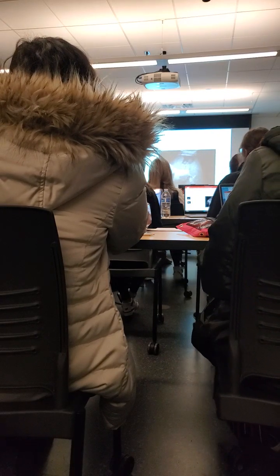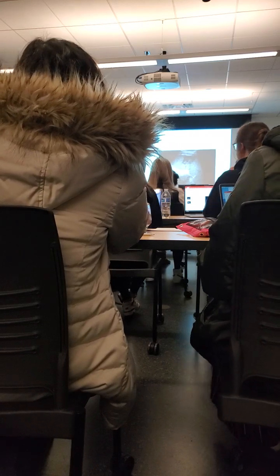Your notch is gonna go the same place that it goes on your home screen, sector image, top left corner. Well, feisty there. Okay, everybody have one of these bad boys? It's got a notch.